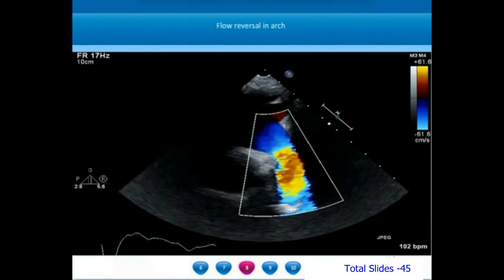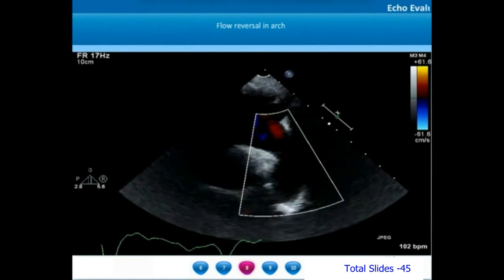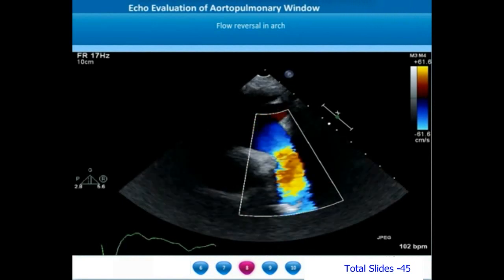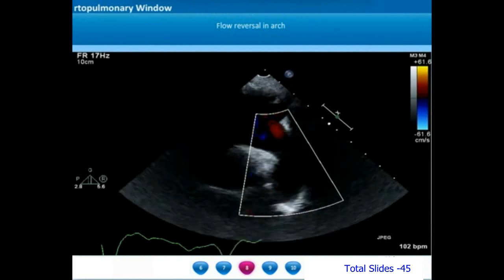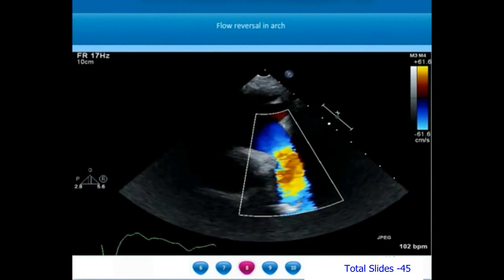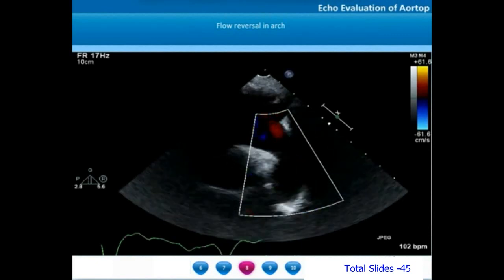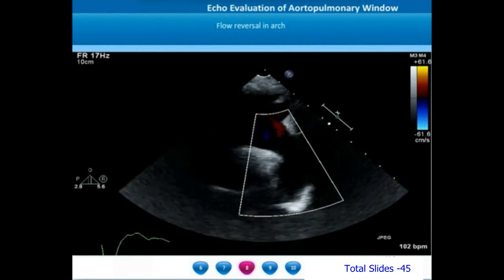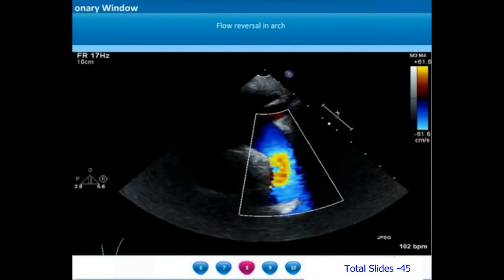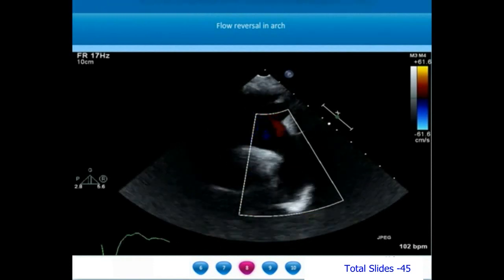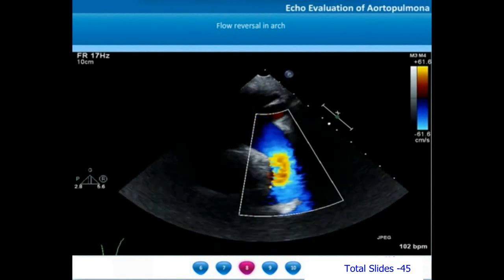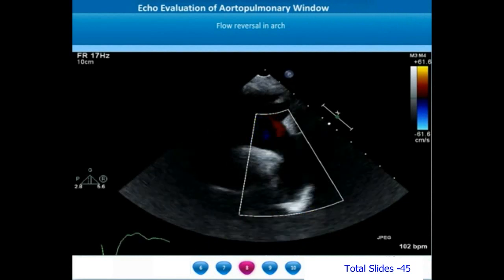When we look at the flows in the suprasternal view, if the distal aortic arch is showing a diastolic flow reversal, that is also an indicator of aortic runoff lesions, one of which will be the aortopulmonary window. In the color flow of the distal arch, we see a blue color in systole, but during diastole there is a red color indicating flow towards the transducer — a flow of blood from the descending thoracic aorta into the arch of the aorta in diastole.